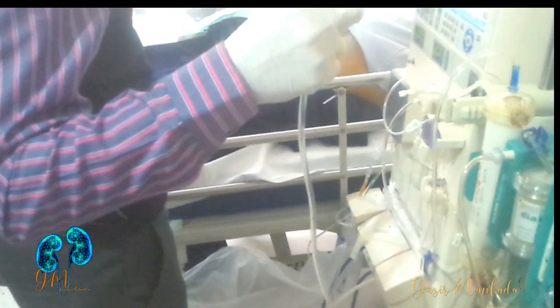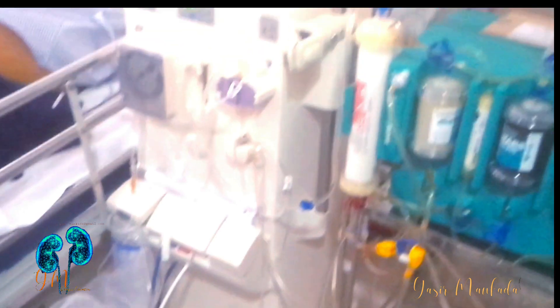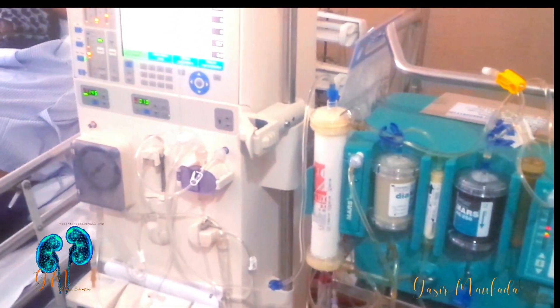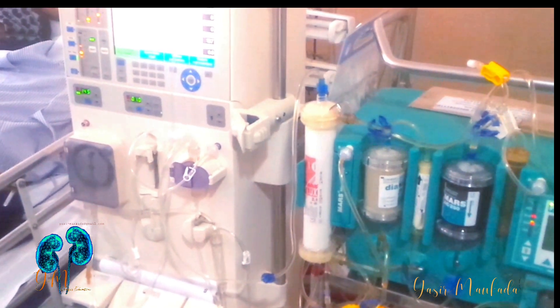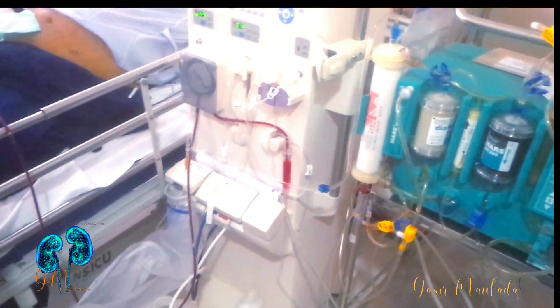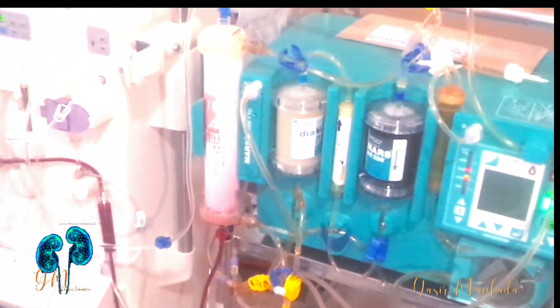The Molecular Adsorbents Recirculation System, or MARS, is the closest we have to an artificial liver. MARS cannot replace a liver, but serves as a bridge between liver failure and transplant. It works by transporting the patient's blood to a filter called the MARS flux dialyser, where plasma is separated.